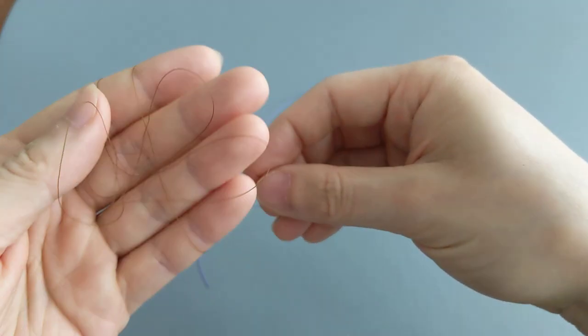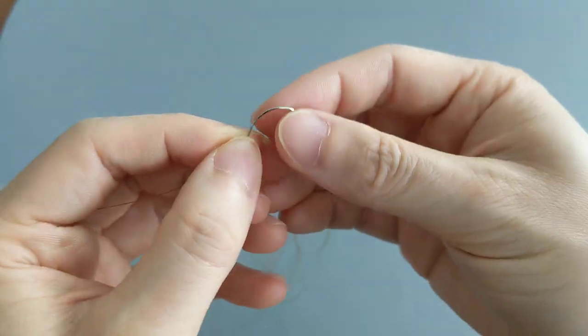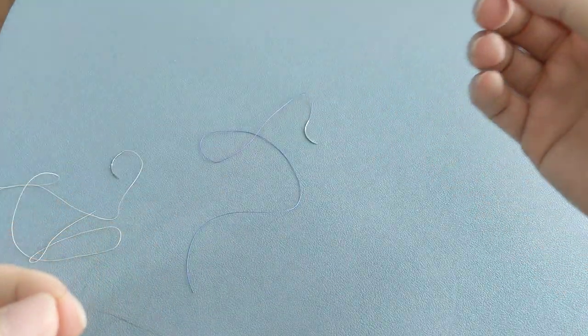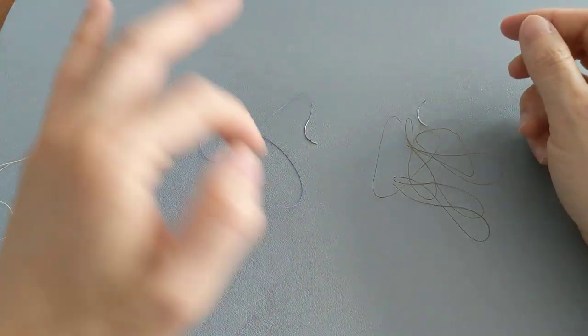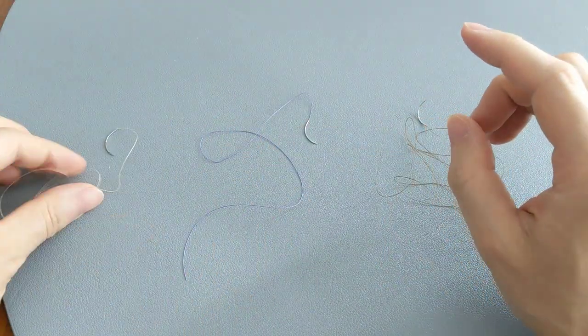But appearance-wise, they all kind of look fairly similar to one another. They all have the needle followed by a long thread, and basically these threads could be different colors, although all of them technically can come undyed like this one.